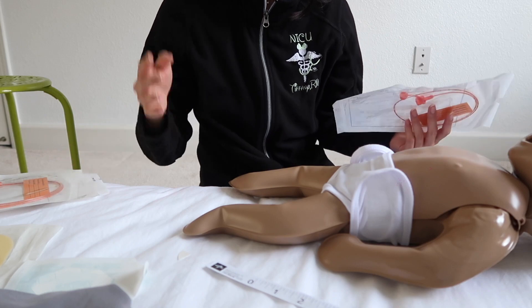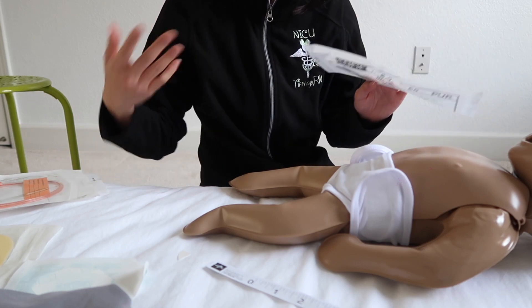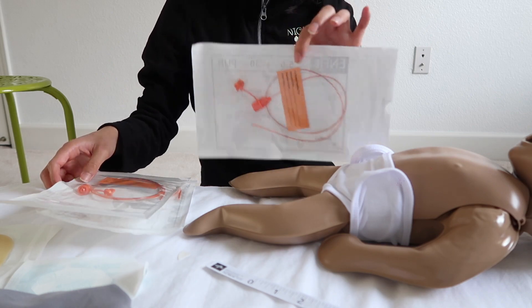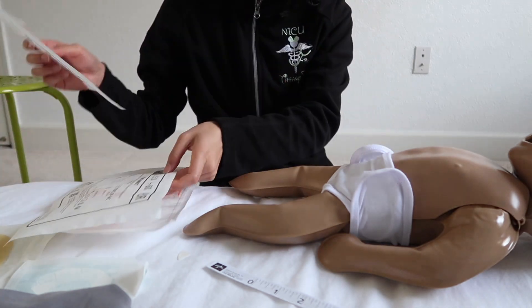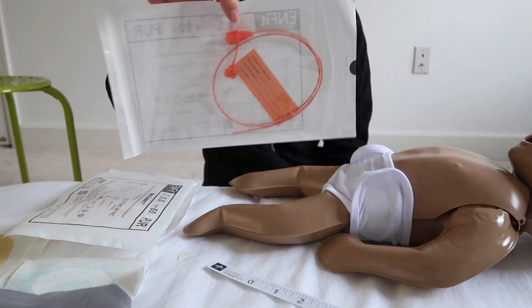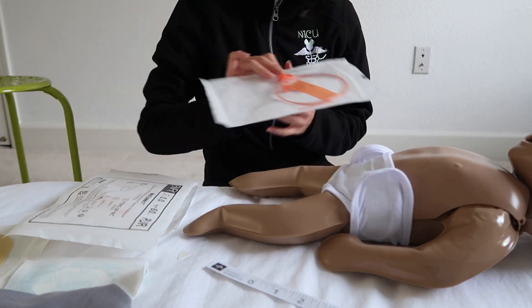Make sure to look at your hospital's policy for each patient's age, weight, and gestational age regarding tube size. We use the 5 French for a lot of our preemies, and the 6.5 French for somewhat older preemie kids. That's the one I'm going to use today.